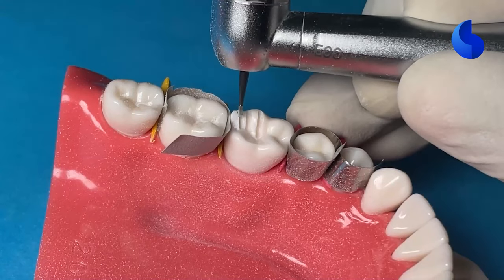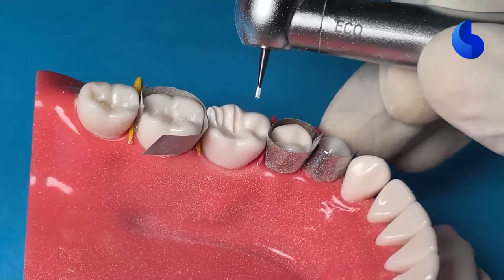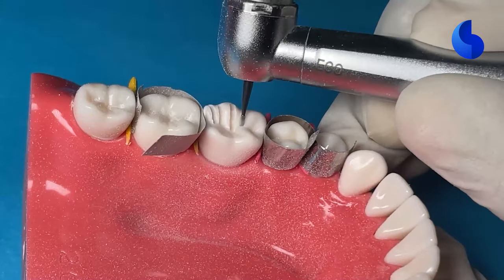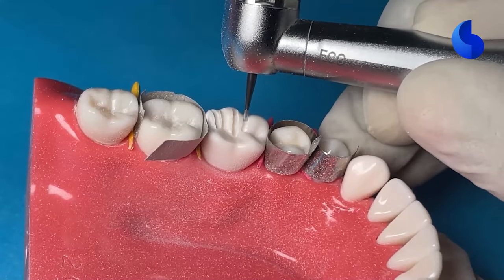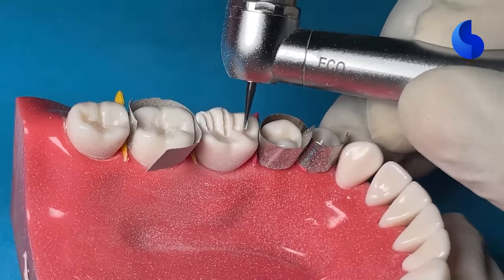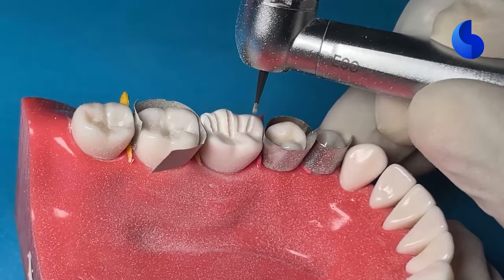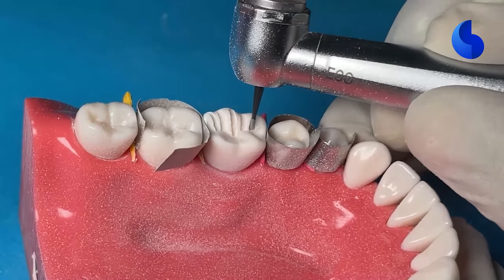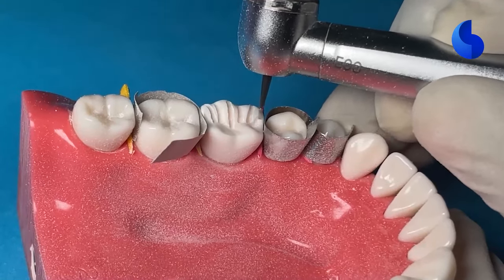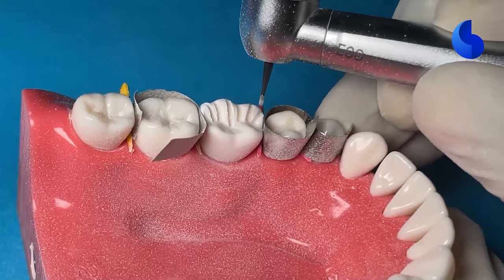So there are several ways of creating these depth orientation grooves. Like we're showing you in this video, you can use a carbide burr. In this case, we're using a 330. You can also use a diamond burr. I personally like to use a mix of these. I use the carbide burrs and grooves and then the diamond burrs. In this particular preparation, we're mostly using the carbide burrs to create the depth orientation groove.